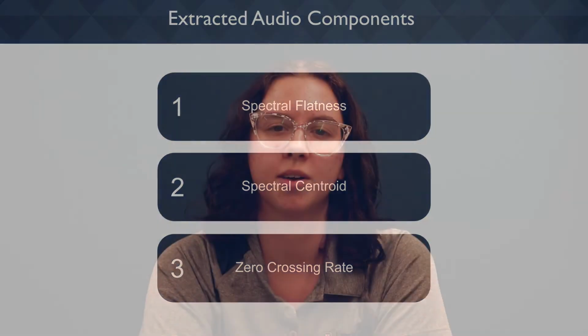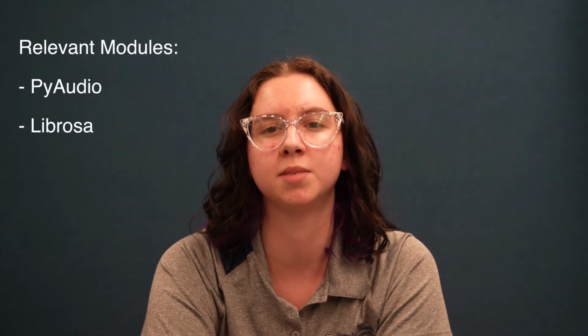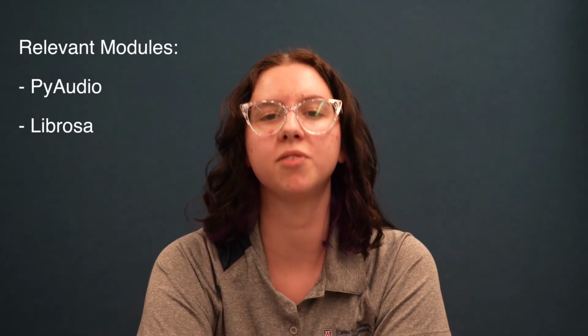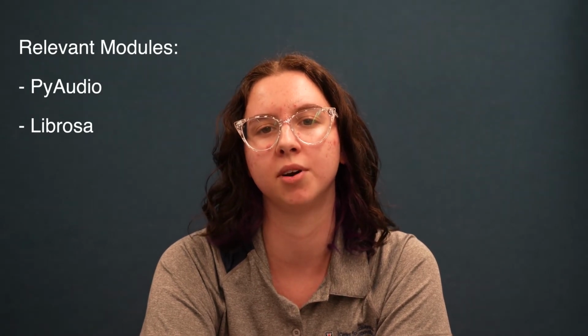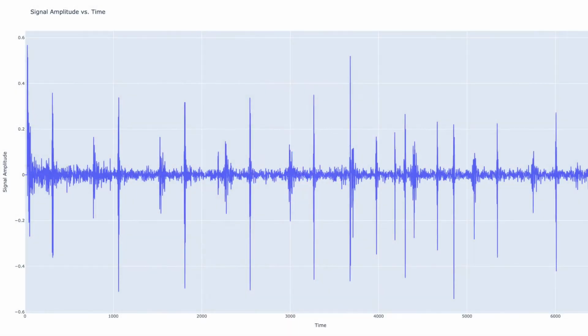The Python PyAudioAnalysis library was used to load in the audio files as well as to visualize the frequency spectrum for each signal. To perform the feature extraction portion, the Librosa library was used in Python because of its built-in feature extraction functions. The averages of each array of feature values were then taken to obtain the average of each feature over the whole signal to help characterize the spectrum of heart and lung audios. To verify these values, testing scripts were generated using MATLAB to compare the values of these features using sample audios to determine the accuracy of the Python analysis.